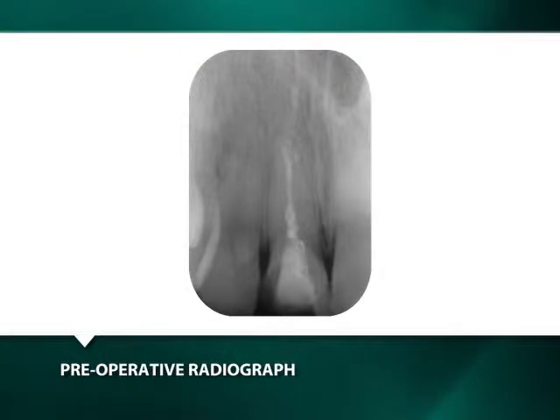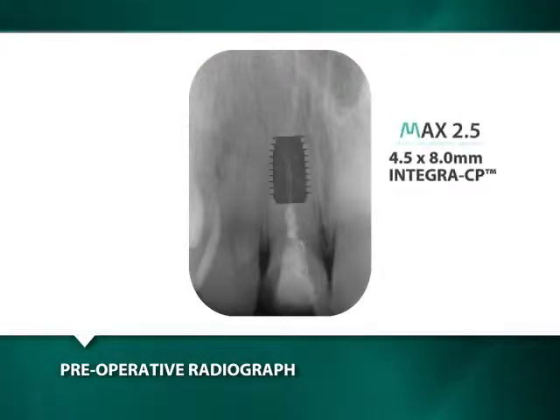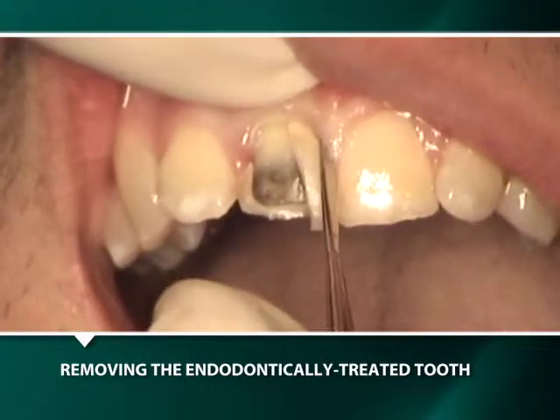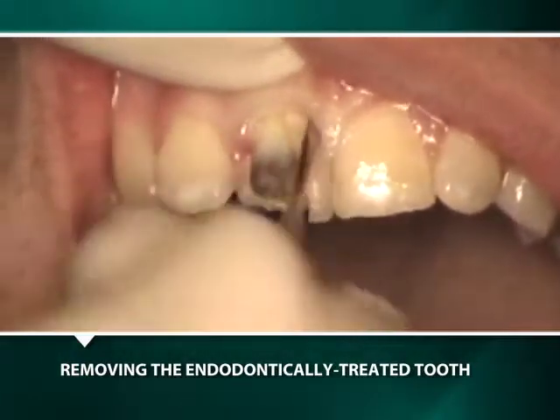This case demonstrates the extraction and immediate placement of a 4.5 by 8 millimeter implant for a maxillary central incisor and its restoration with a Bicon integrated abutment crown. The extraction of the previously endodontically treated tooth is initiated.